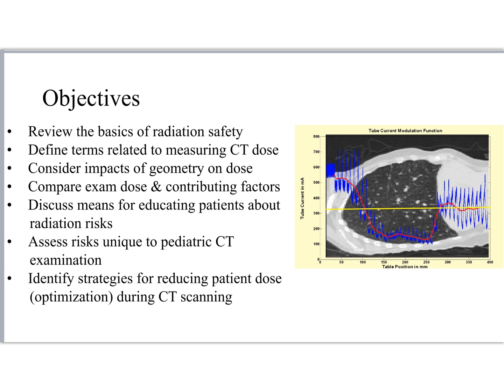And I want to just point out, this is an example here from industry of tube current modulation. I have it here as a reminder to me that a lot of parts of CT dose safety actually are counterintuitive. So for example, in this CT scan, the tube current is being modulated as a function of the amount of density of tissue that the beam has to penetrate as it moves through the thorax and into the abdomen.